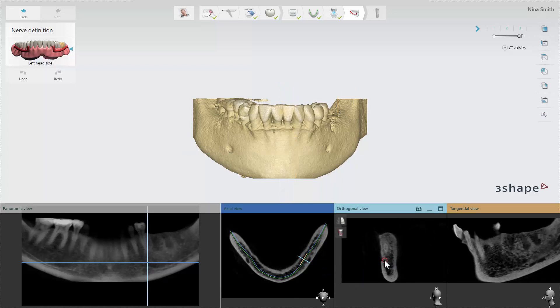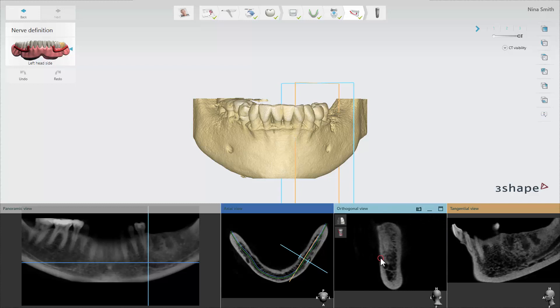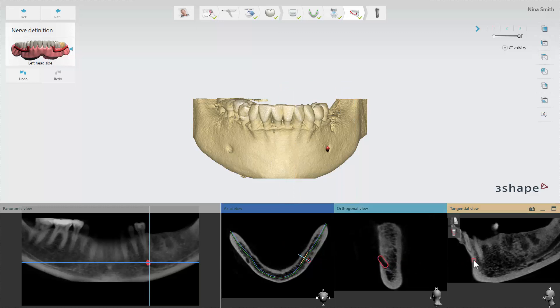A red circle will appear and by clicking once you mark the exit point of the nerve. Then you move down the nerve canal and by clicking again you can continue defining the nerve.